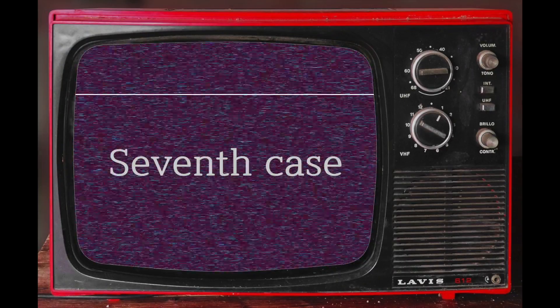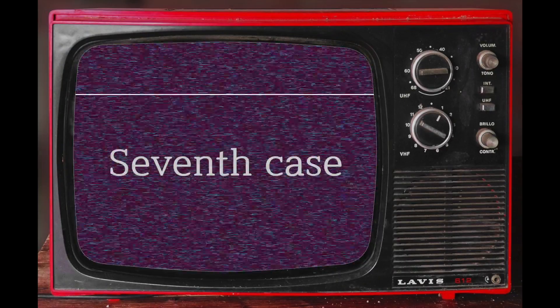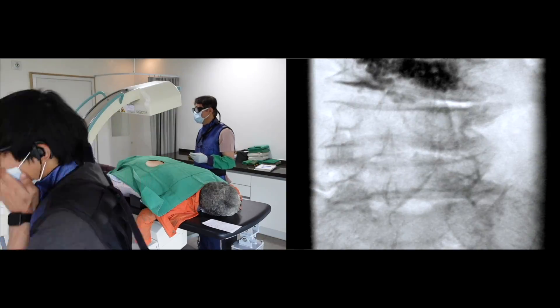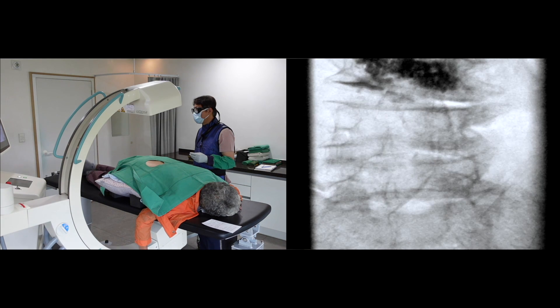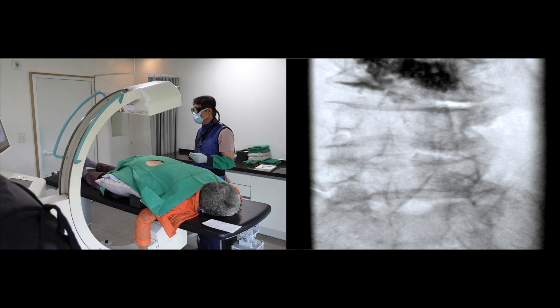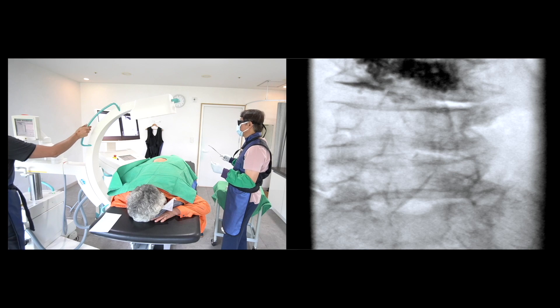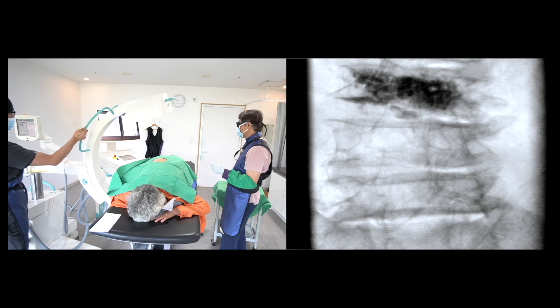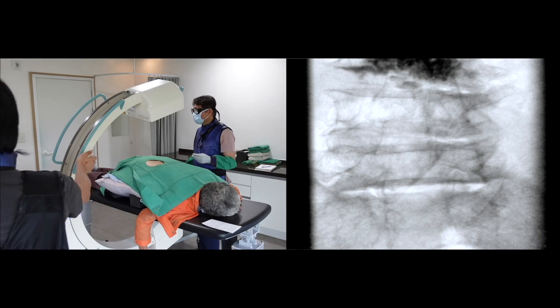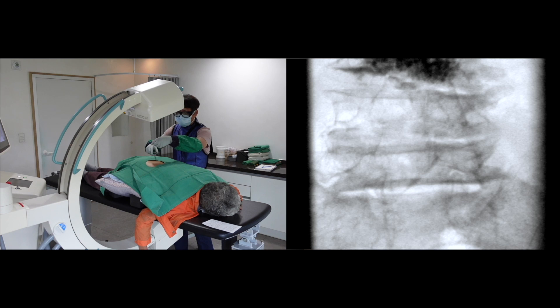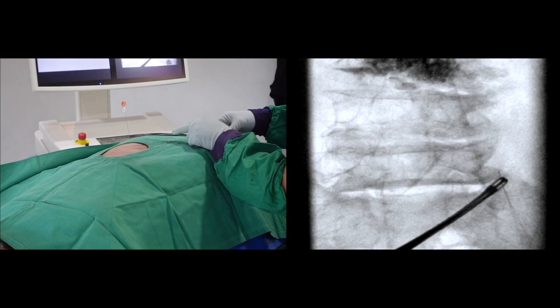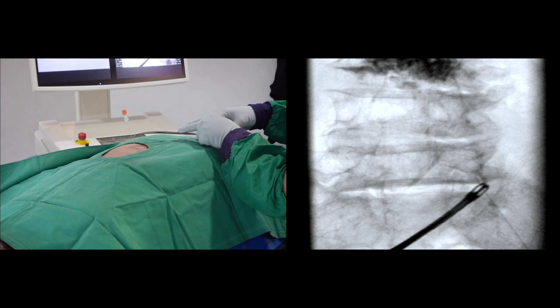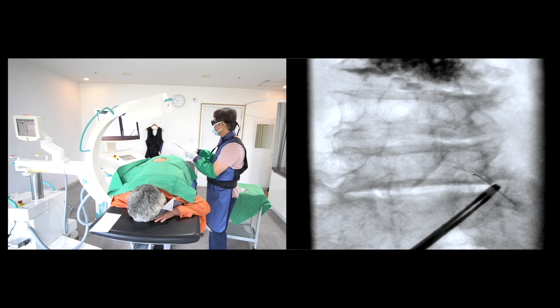Let me present the seventh case — it is a challenging case. My target will be the right L5 and L4 nerve roots. I will show you an ipsilateral lateral oblique view. Osteoporosis, disc space narrowing, and marginal spurs are common features of elderly patients.